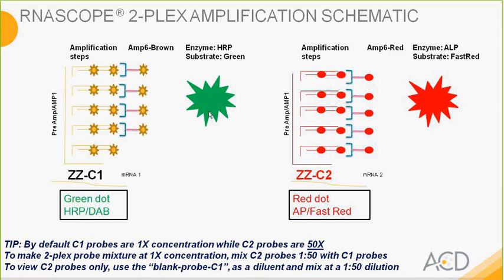To view C2 probes only, you can use blank probe that's provided by us as a diluent, and you can still use the same dilution at 1:50.